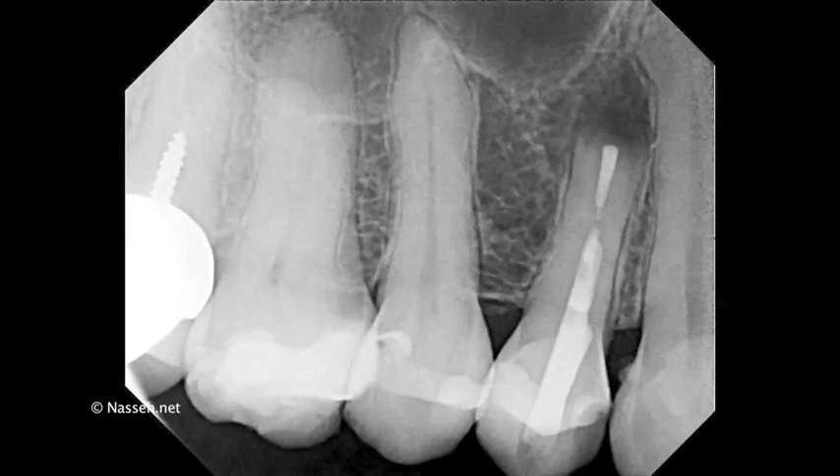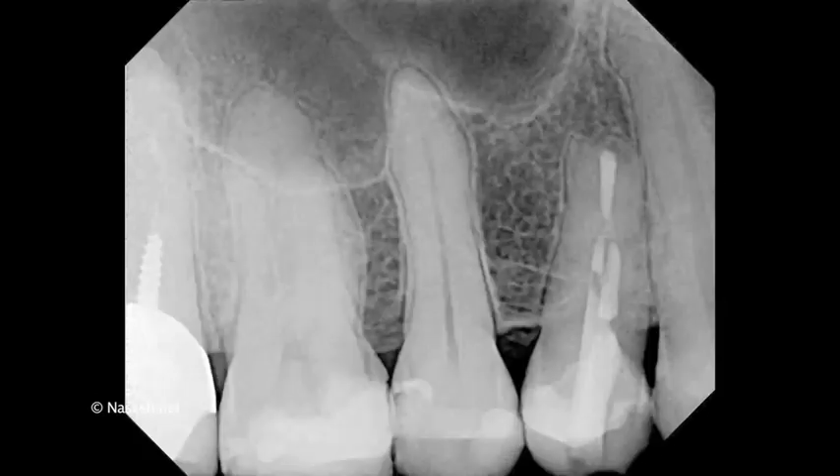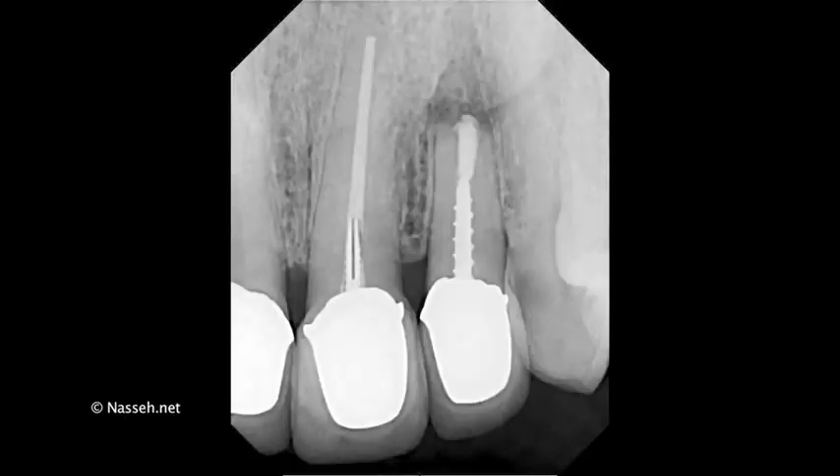I'd like to show you a couple of post-ops with healing. This is tooth number five, the first premolar, that had an apicoectomy with the technique that I mentioned. You can see the lesion — this is a one-year follow-up of the case. You can see complete healing of the apex, one year following surgery and placement of the bioceramic retrofilling material.